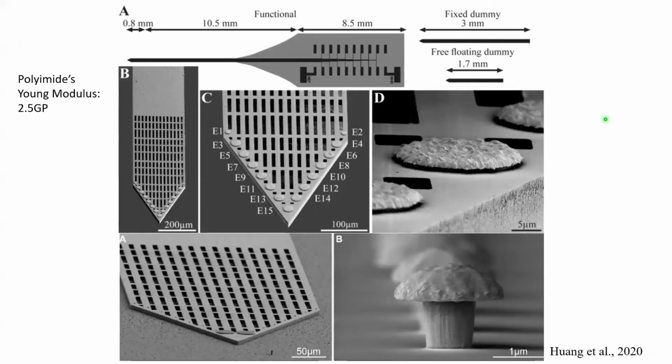As I mentioned earlier, there are abiotic and biotic parameters that control the integration of the implant with the brain parenchyma. I will not go into details, but to overcome the abiotic aspects of this issue, our lab has developed a special MEA platform which is composed of polyimide, which has a smaller Young modulus than that of a silicon-based platform. Young modulus is simply a measure of a material's stiffness. You can see that it is also perforated. Those black rectangles are perforations. It can carry our three-dimensional mushroom-shaped electrodes, which are those little dots here, and the planar electrodes.